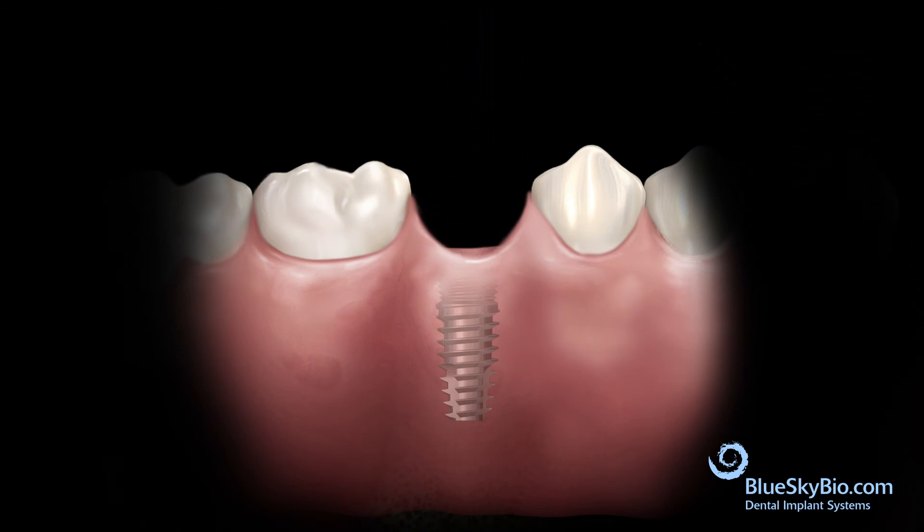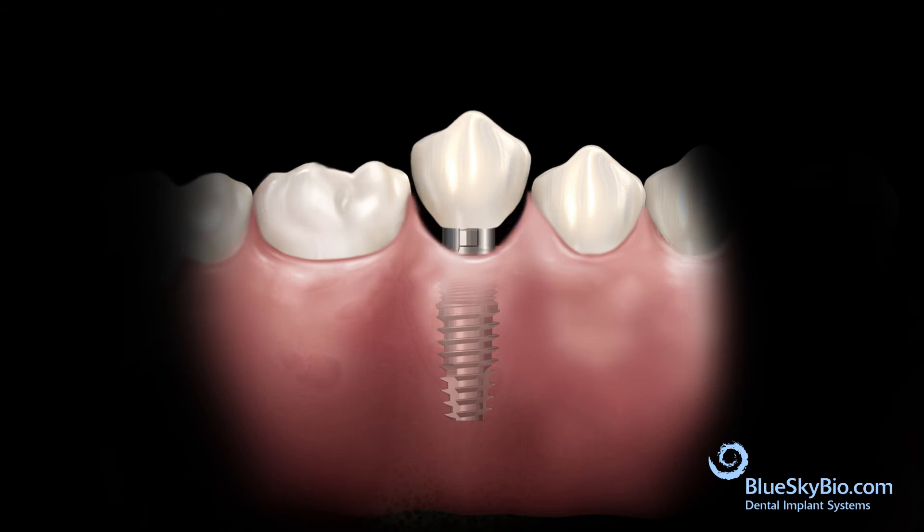Insert the abutment into the implant and tighten the screw with light finger pressure. Place the crown on the abutment and remove interproximal and occlusal interferences. Remove the crown and the abutment.